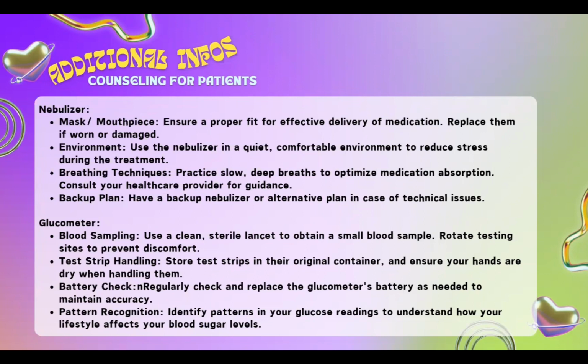Use a nebulizer in a quiet and comfortable environment to reduce stress during the treatment. And while using the nebulizer, practice slow, deep breaths to optimize medication absorption. Consult your healthcare provider for guidance. Have a backup nebulizer or alternative plan in case of technical issues.